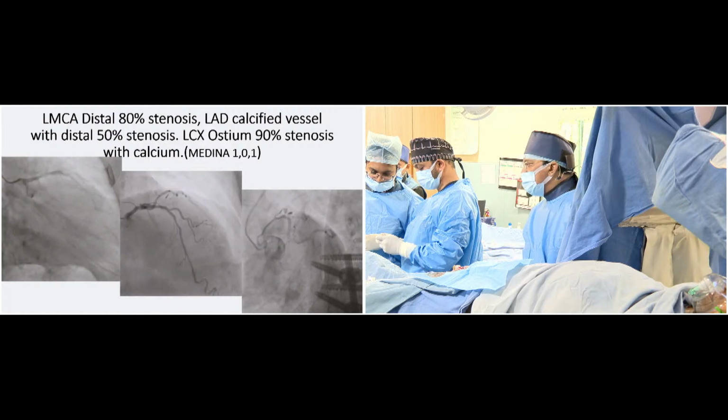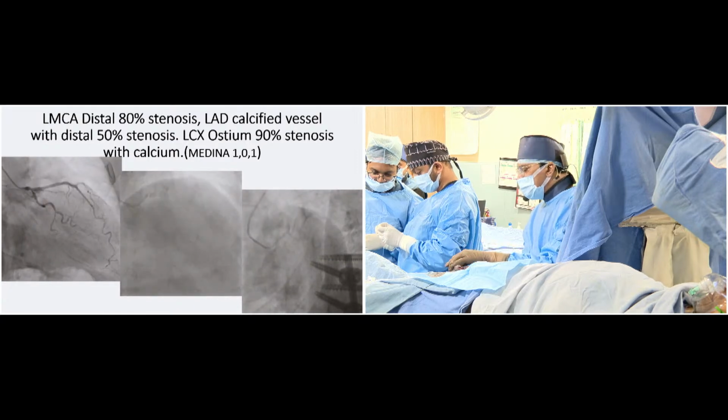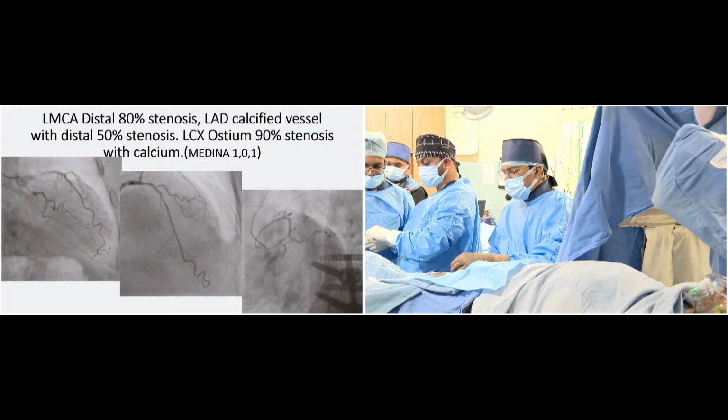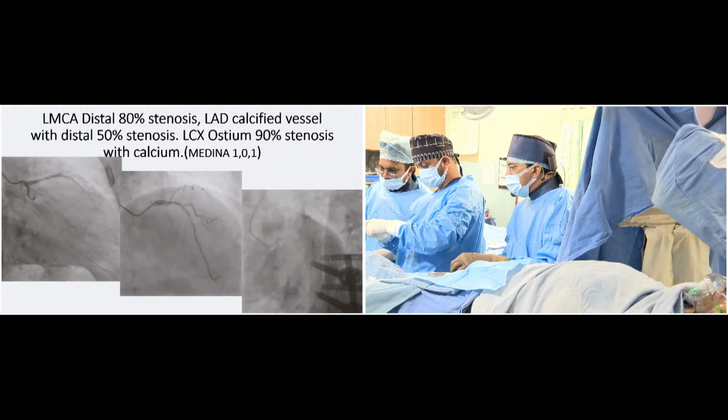Once you press again it will be off. So movements are very limited, and even a single operator can use the ROTA Pro. That is the advantage. Even ROTA can be used. This is much more handy and more useful.